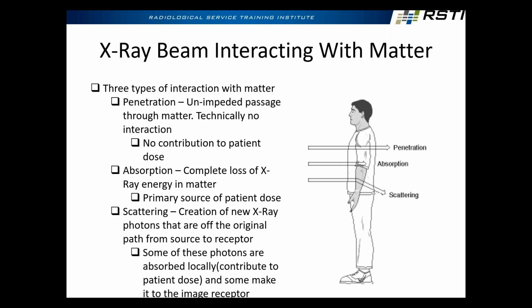That's not what was going on here. I said, what exactly do you think that does? And he literally thought that his dosimeter was like a radiation magnet and that it would suck all the radiation to it and he wouldn't get any. So we had a nice long talk that involved him going, oh, a lot. And then he stopped doing that dumb stuff, I hope. But, you know, it's ionizing radiation. You can't see it, you can't feel it, you can't taste it. What harm could it do?